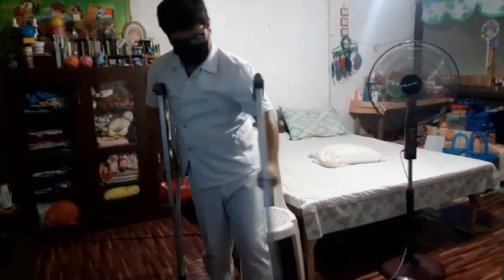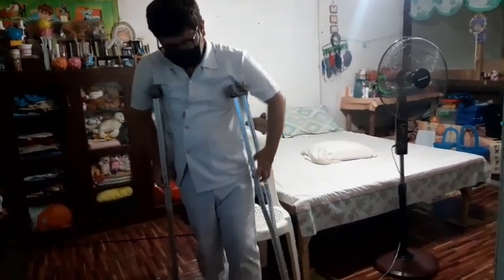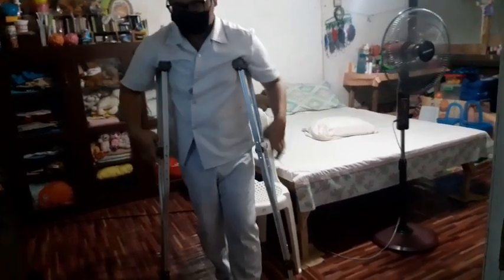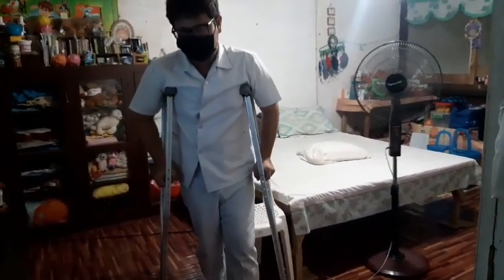Then observe the return demonstration and help the client practice until proficiency in crutch walking is attained. Wash hands and properly store the equipment. For our evaluation, we evaluate the client's tolerance and reaction to the procedure, and then assess if the client is able to demonstrate safe independent ambulation with the assistance of crutches. Assess if the client feels confident while using the crutches safely.